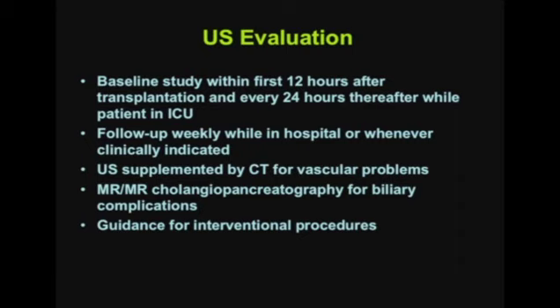In my hospital, we perform a baseline study within the first 12 hours of transplantation and every 24 hours thereafter while the patient is in intensive care. We subsequently will follow up with weekly ultrasound evaluations while the patient remains in hospital, or more frequently, essentially whenever clinically indicated.